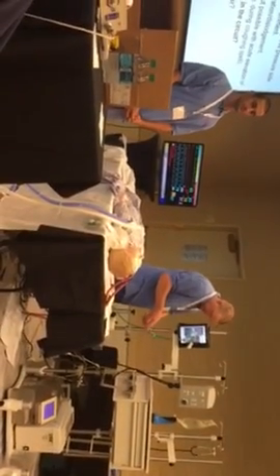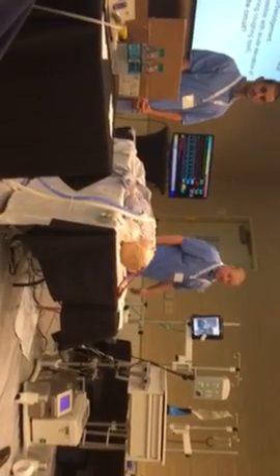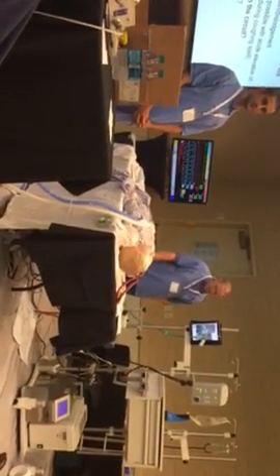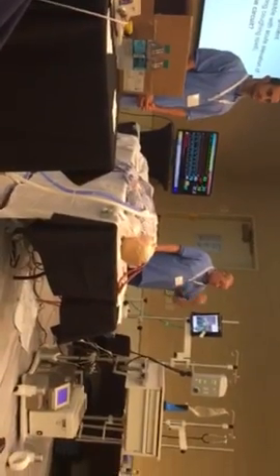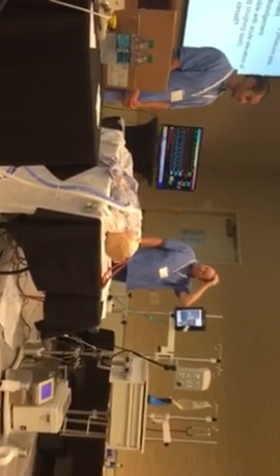And so it's probably, if you had an acute bolus right into the front of the oxygenator of about 50 or 60 mLs, that's when you would probably see it start to cross over. But if it's a slow trickle of 60 mLs, it's probably just going to vent it and not going to be an issue. Yeah, I mean, it was very effective, too effective for our case, really.